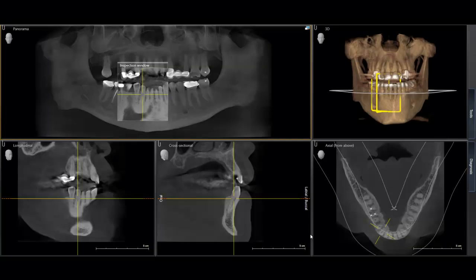Hi, this is Dr. Steven Hernandez with cdocs.com and today I wanted to share with you a tip on how to make a PA from your cone beam volume. Something happens — you've forgotten to capture a PA before a procedure, the patient just can't tolerate the x-ray — what do we do?